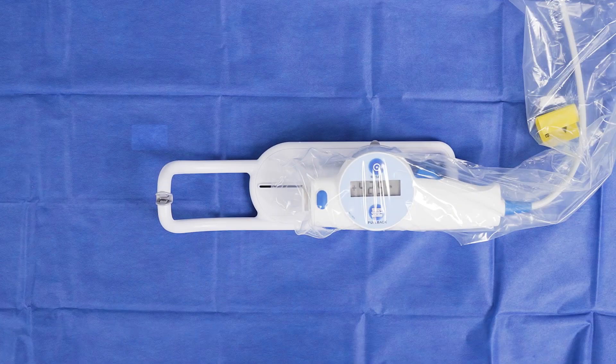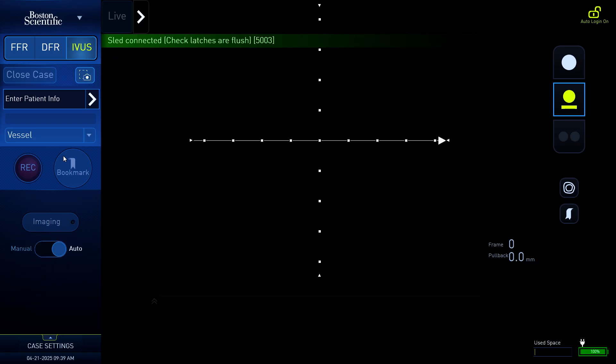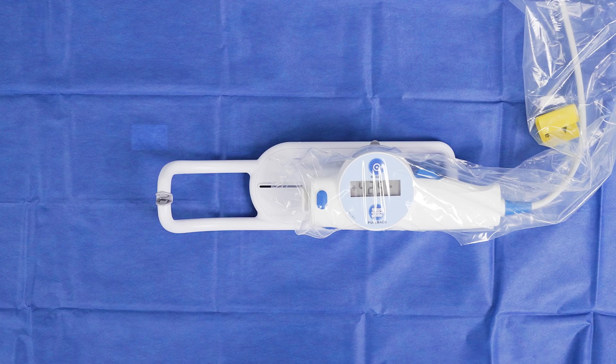Do not proceed unless both the top and bottom latches are flush with the sides of the sled cup. The liquid crystal display lights on the MDU may illuminate, but if the MDU is not properly latched, pullback will not occur. Verify that the system shows the sled is connected. The MDU and sled are now ready for use with the catheter.